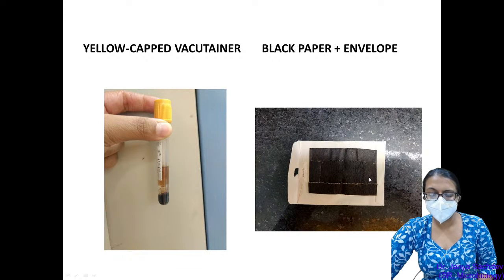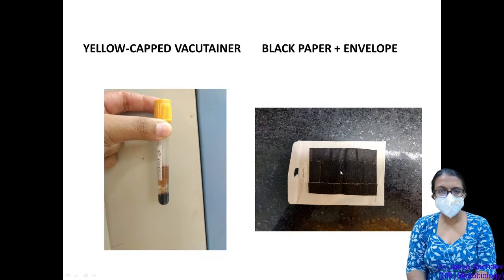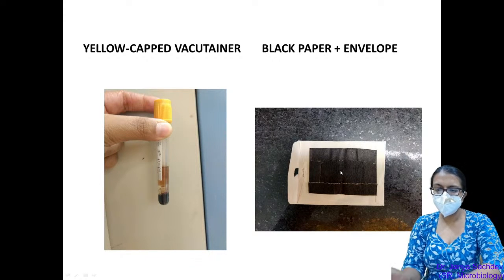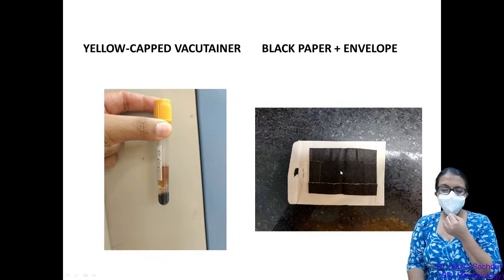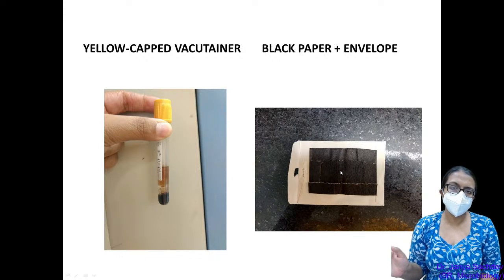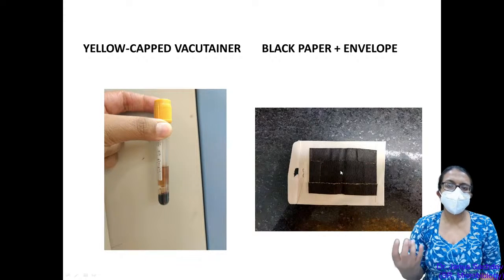It absorbs moisture. So after a skin or a hair or a nail sample is placed on the black paper, usually what is done is, the skin or nail is scraped directly from the patient's affected area. It's held over the black paper and scraped onto the black paper. And then this is folded and put into the envelope, and then in the mycology laboratory we allow it to dry for a few days. The paper absorbs moisture from the sample and all the bacterial commensals, any yeasts, any kind of environmental contaminants, all of those will die due to the dehydrating effect of the hygroscopic paper.